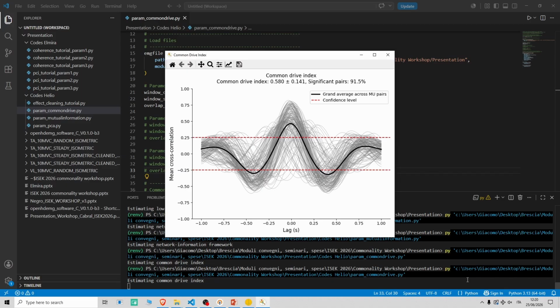Really good question. Until now, no. But I will cover in a few minutes that we also implement the possibility to overlap. Okay, so right now we are doing it with 0 overlap, meaning that we split in non-overlapping windows, but we have the possibility also to do 10, 20, 80% of overlapping.